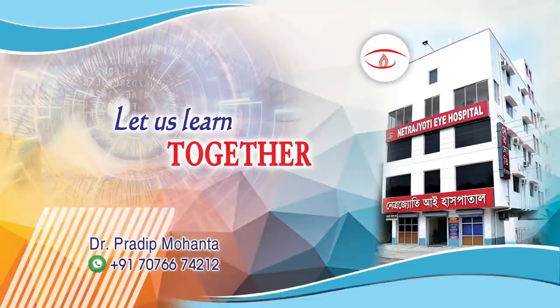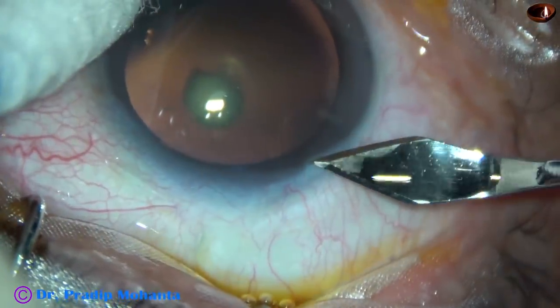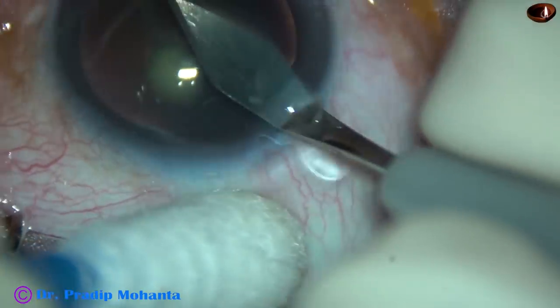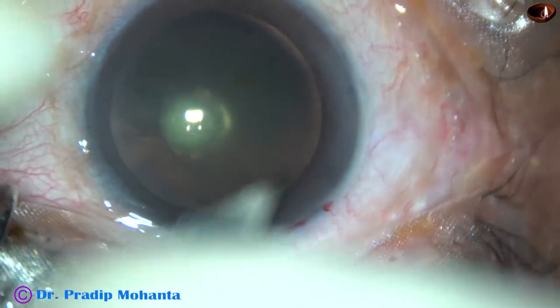Friends, welcome to my workplace at Ranaghat, West Bengal, India. This cataract appears like a posterior polar cataract. I did a lot of blunders in this case. Let us observe this surgery. It is true that we learn more from our mistakes than from uneventful surgeries.